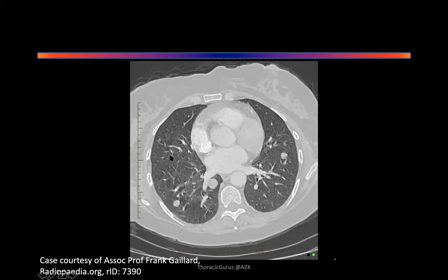I don't mean to put you on the spot, but this is what happens, that when you get so hooked onto these nodularities, they really glare at you, and you get so hooked on the pathology that you completely miss this. Okay, there's something happening in the heart. You described to me beautifully the heart and everything, but this is an obvious pathology. Or something is not right, yeah? So you must say there is some opacity or density on the right side. Okay, whatever it is, I don't want you to diagnose it, but at least describe it to me.